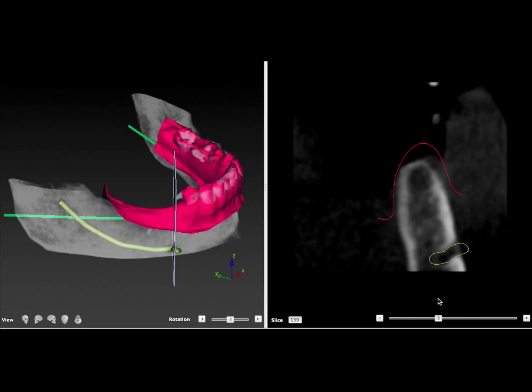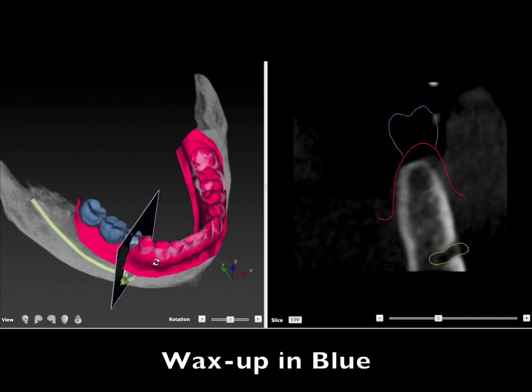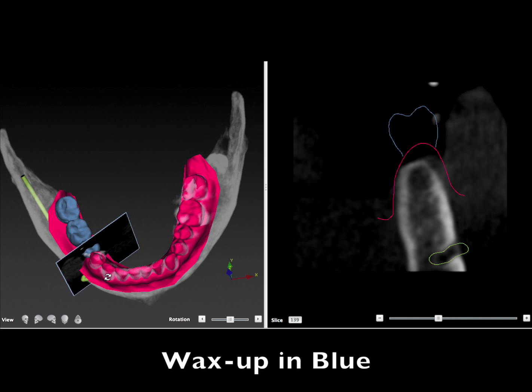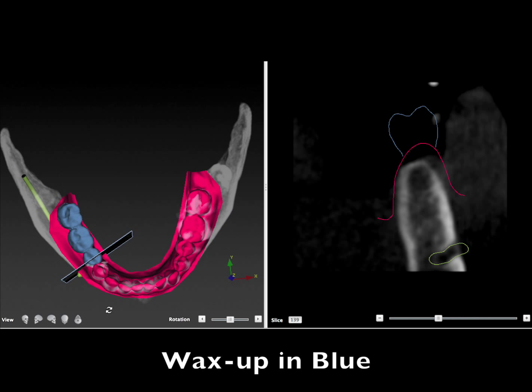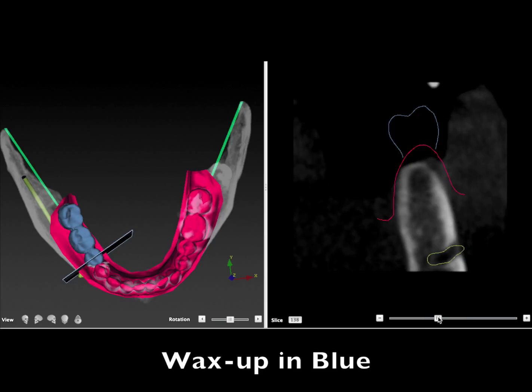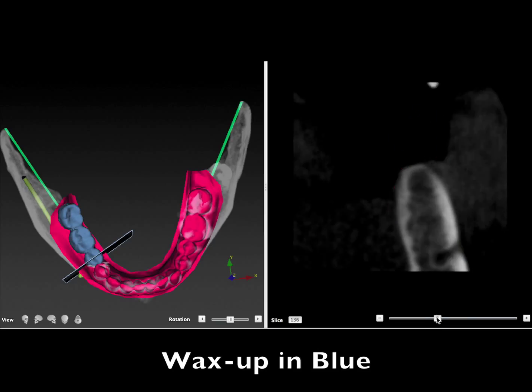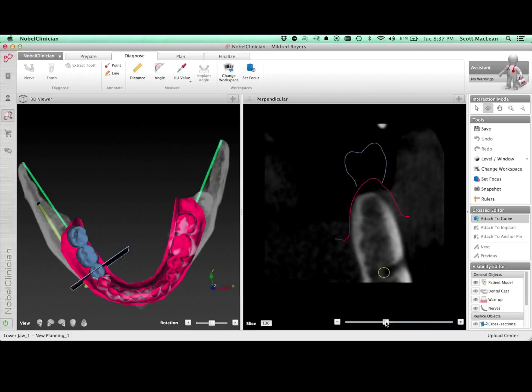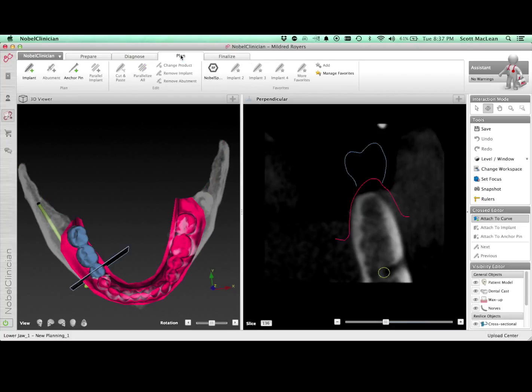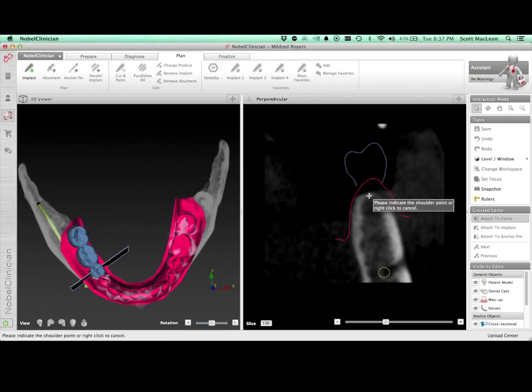We can also do a wax up, which is based on the occlusion of the upper teeth. So now we have all the information that's needed because we know where we want the final teeth to be in this particular arch. Then we can plan the implants to be exactly where they should go so we can maintain a screw-retained position.